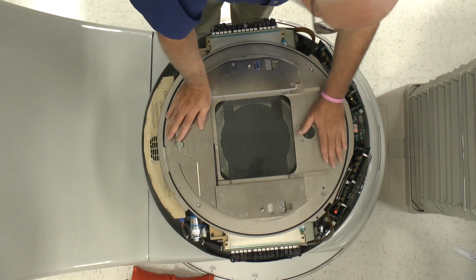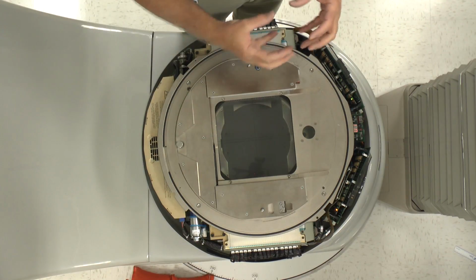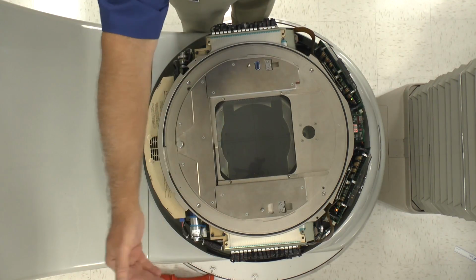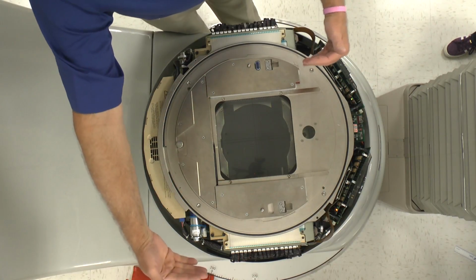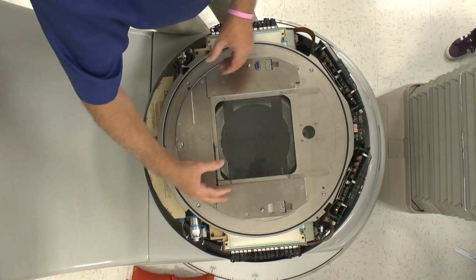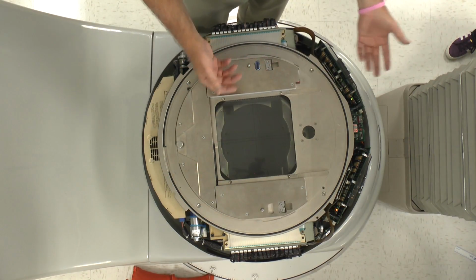So I always look inside the system. Up is moving in, down is moving back. I always try to move the leaves in. If I know that the leaves, not the carriages, the leaves are in, then you can safely move a leaf back.